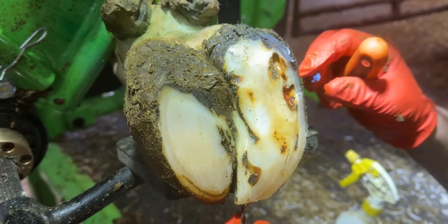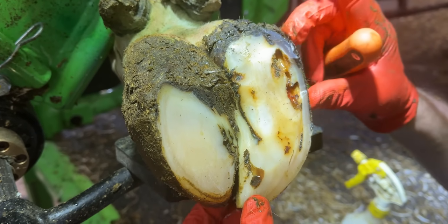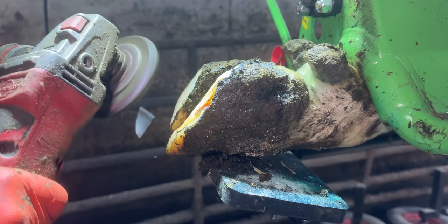I think what we're going to do is reduce this part of the hoof with the grinder because it's so hard.